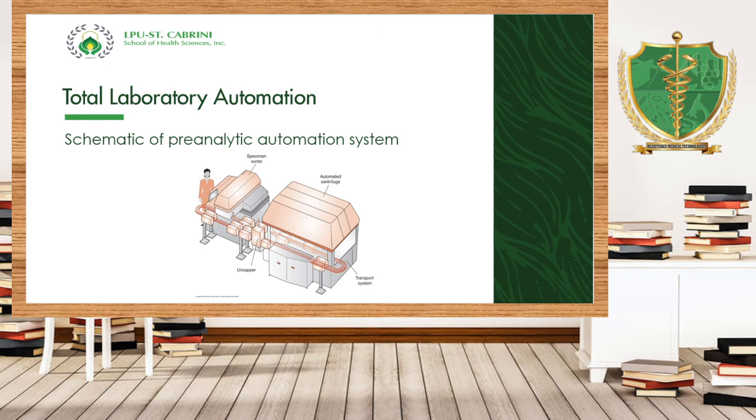I don't know if you were able to watch the videos that I've uploaded in our learning management system entitled Knowing Your Clinical Chemistry Analyzer. There is one analyzer, I think that is Cobas. I forgot that specific brand of the analyzer that is capable of performing the sample preparation.